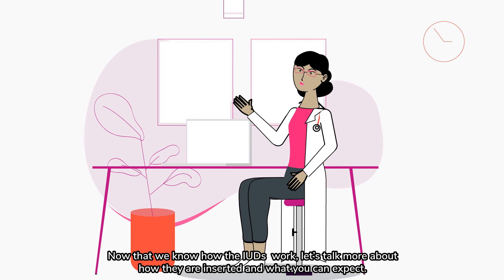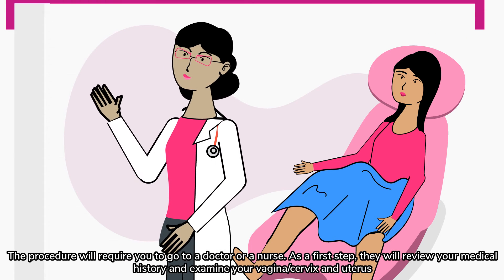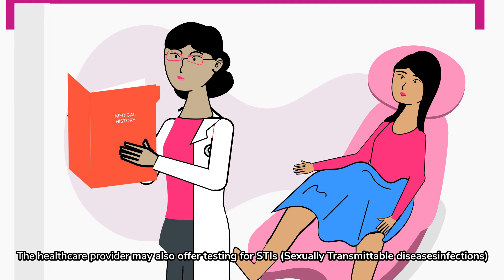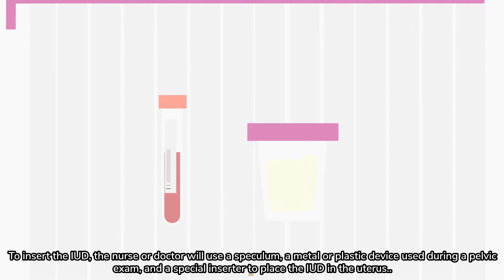Now that we know how the IUDs work, let's talk more about how they're inserted and what you can expect. The procedure will require you to go to a doctor or a nurse. As a first step, they will review your medical history and examine your vagina, cervix, and uterus. The healthcare provider may also offer testing for STIs or sexually transmittable infections.